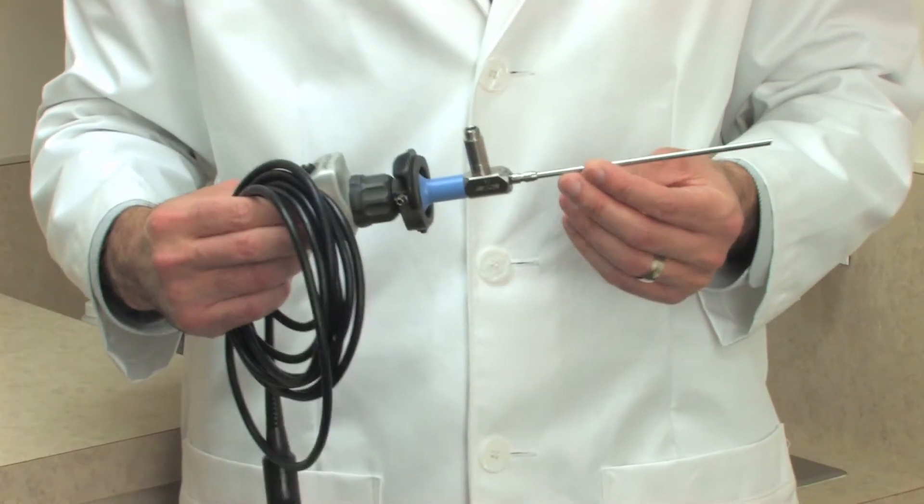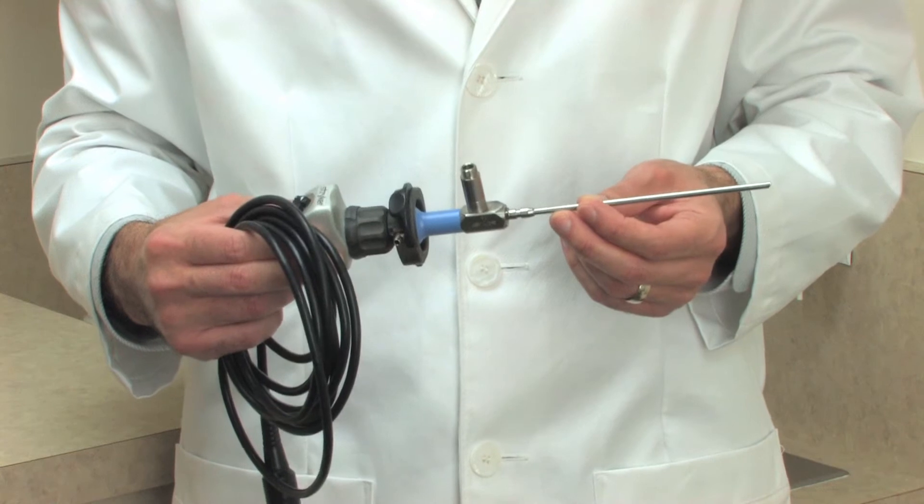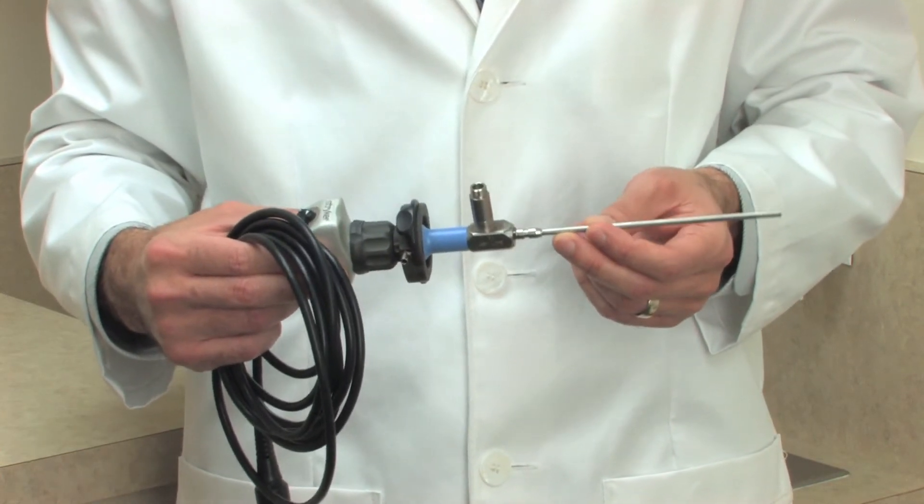A long thin fiber optic camera called an arthroscope will send high-definition video images to a screen in the operating room. Your surgeon will use these images to perform the surgery.